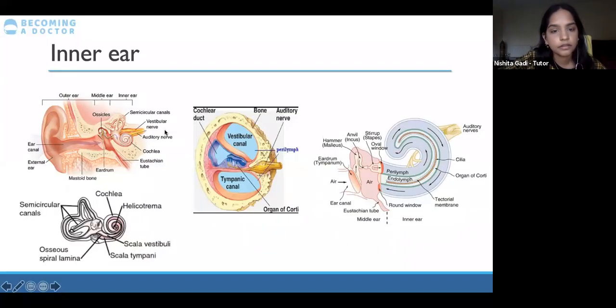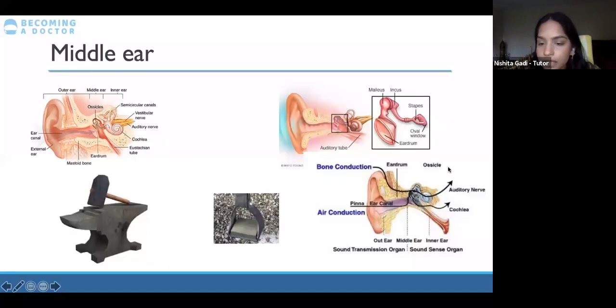Okay, so I also wanted to touch on this, which is really important in a bit when we interpret the audiograms. Normally what we just talked about is air conduction, but sometimes something in this pathway is blocked, for example if there's earwax, or something in the middle ear, or a problem with the ossicles, say there's no incus and the malleus can't vibrate it.